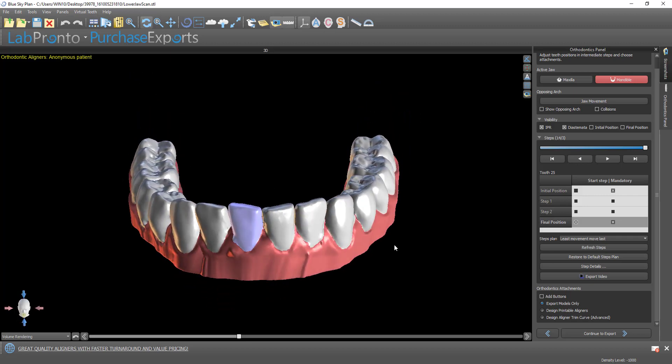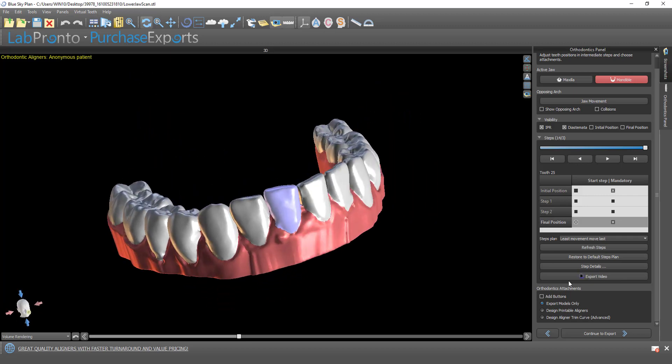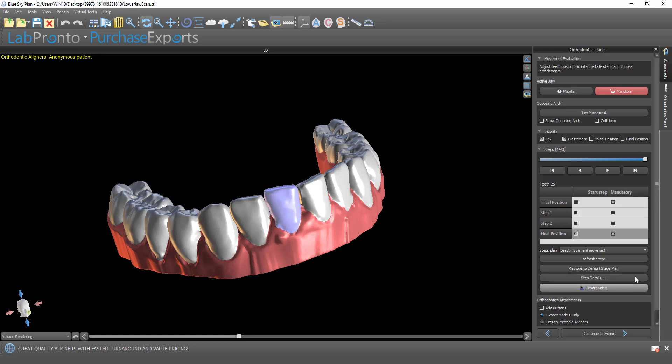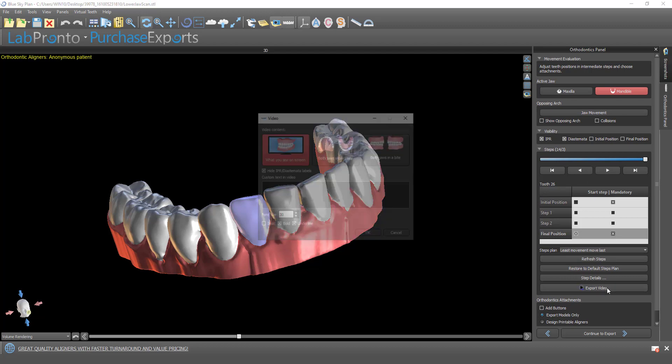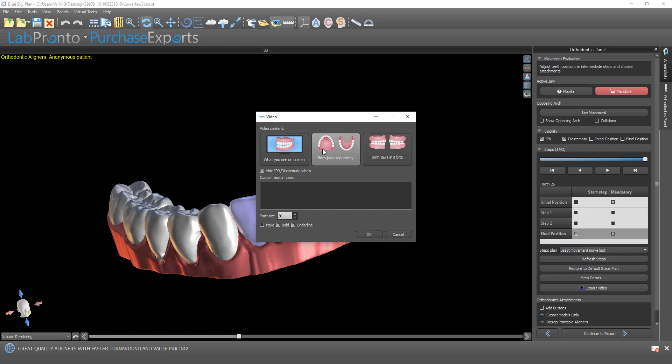So now we're at the stage that we could generate and export our videos. We have this export video button. If you don't see it because there's a lot of steps for a particular tooth, you may have to scroll down slightly in the panel. Go ahead and click on export video. We have three different options here. You could export according to what's visible on screen with the models at whatever angle. You could export both jaws separately or both jaws in a bite.